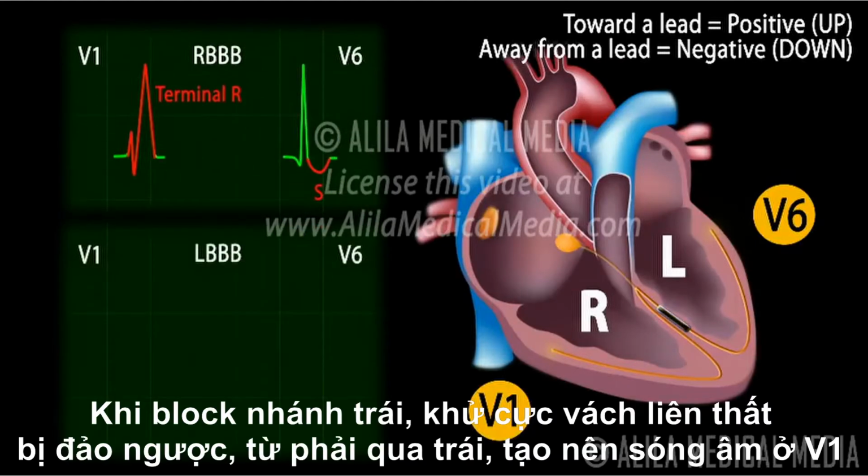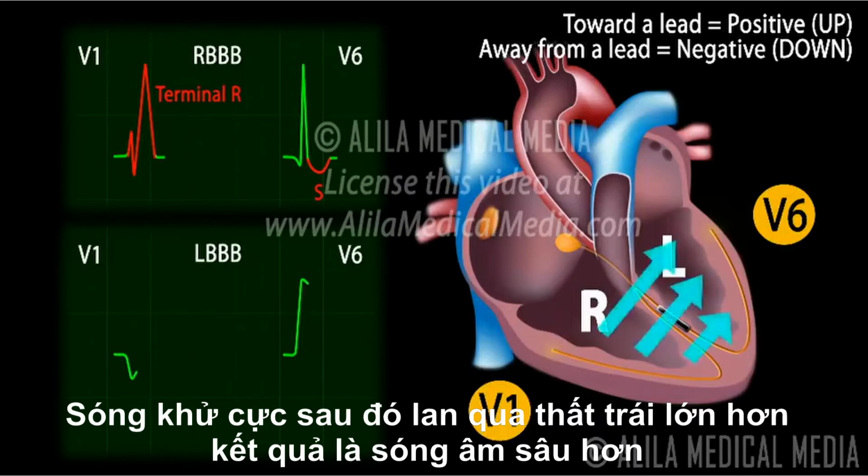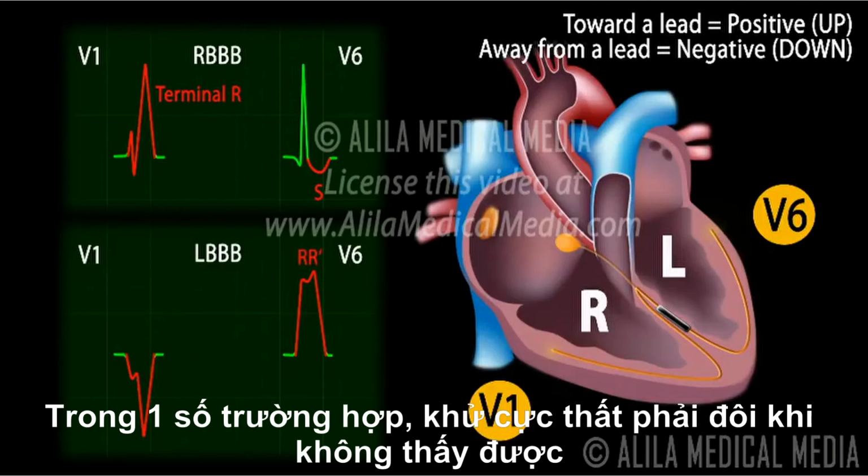In left bundle branch block, septal depolarization is reversed from right to left, giving a negative wave in V1. The right ventricle activates first, with the signals moving to the right, generating a small upward deflection. Depolarization then spreads to the larger left ventricle, resulting in a large downward deflection. Lead V6 sees the opposite, producing a wide, characteristic bunny ears QRS complex with two R waves. In some cases, right ventricular depolarization may not be visible.